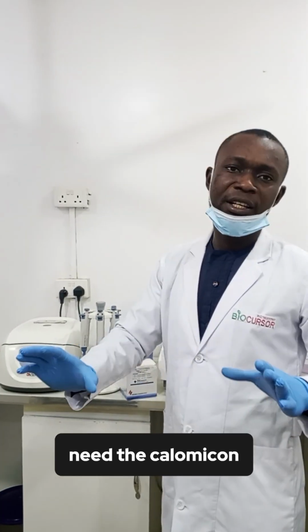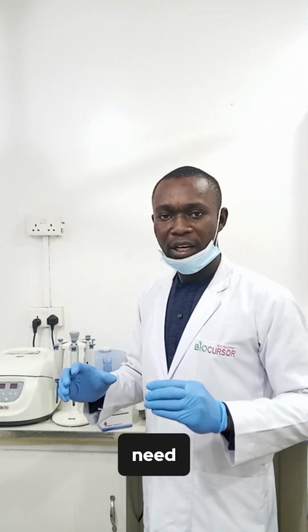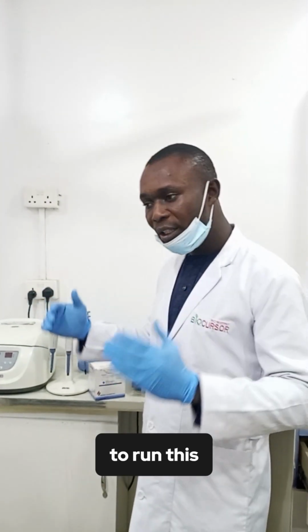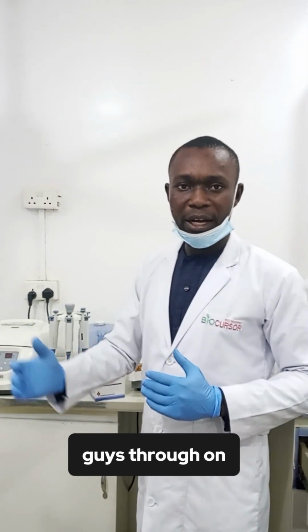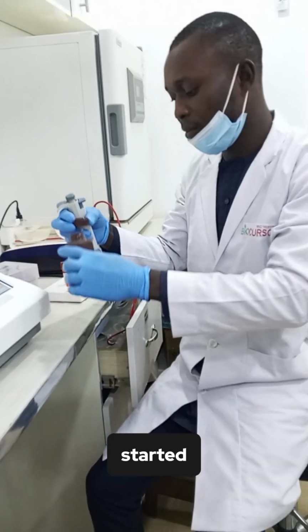So we don't need the chylomicron and we don't need the VLDL. It's only the HDL that we need. So in that case, after the centrifugation, we are going to run this sample and I'm going to put you guys through on how to run this sample using the semi-auto chemistry analyzer. So let's get started.